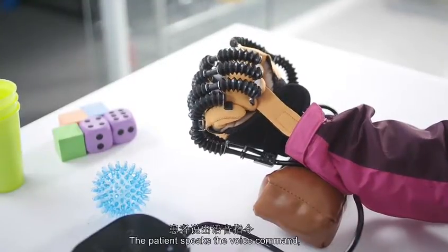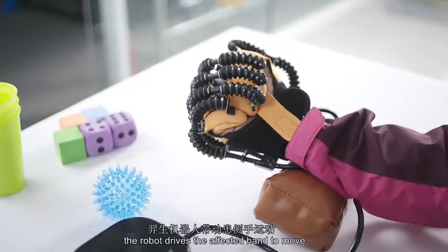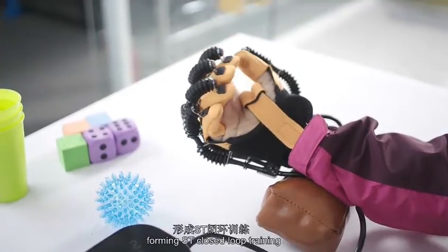When the patient speaks a voice command, the robot drives the affected hand to move, forming a speech-triggered closed-loop training.